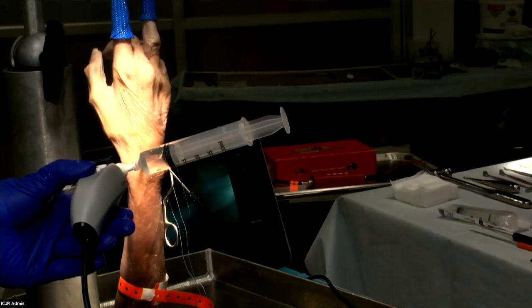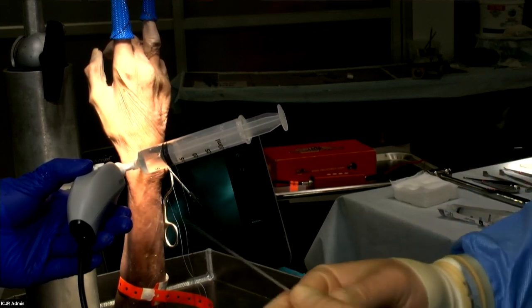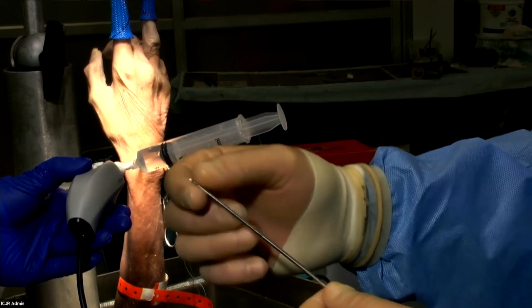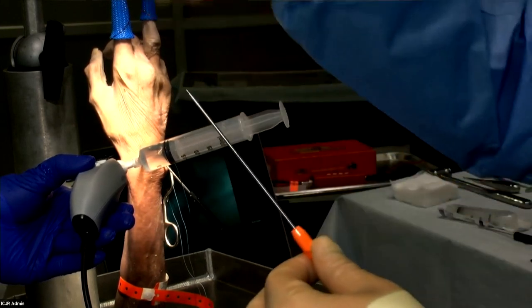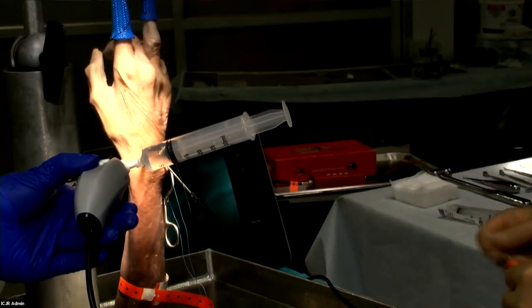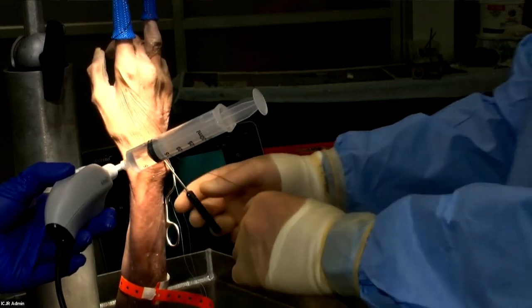Through that tunnel, you use a straight suture lasso. A FiberStick is placed through the lasso — bend it about one inch over the end — then stab through the TFC. Twist it several times and the FiberStick gets stuck on the TFC; then grasp it after removing the suture lasso. Through the same tunnel, pass a nitinol wire suture lasso loop and grasp that as well.